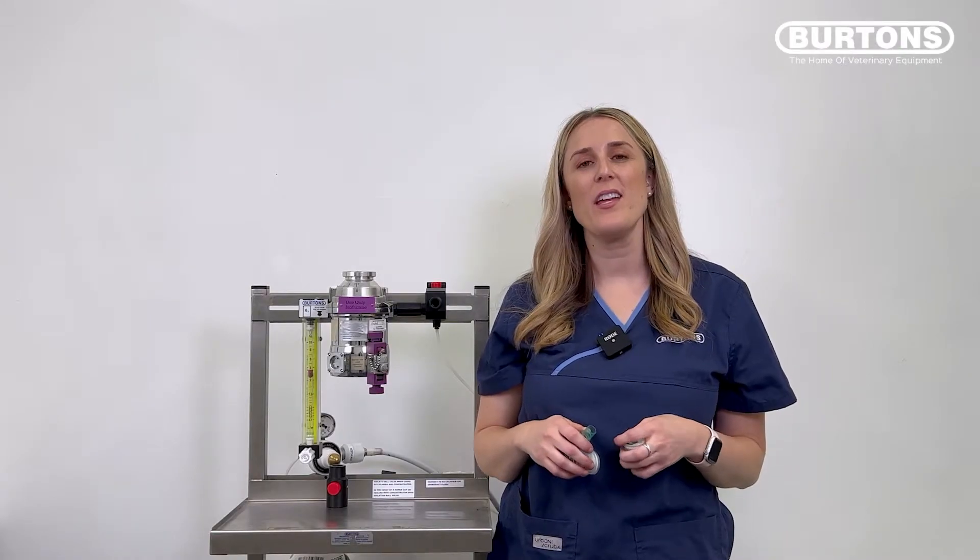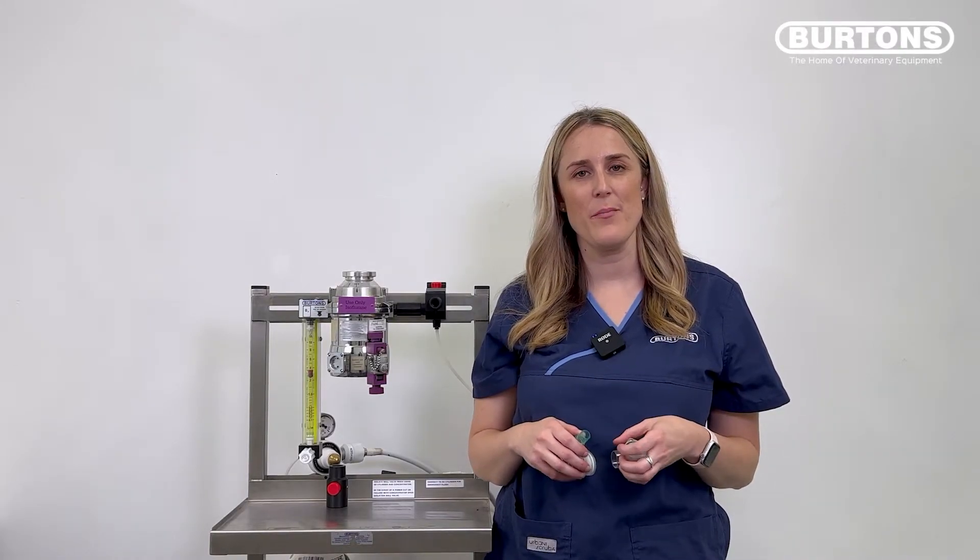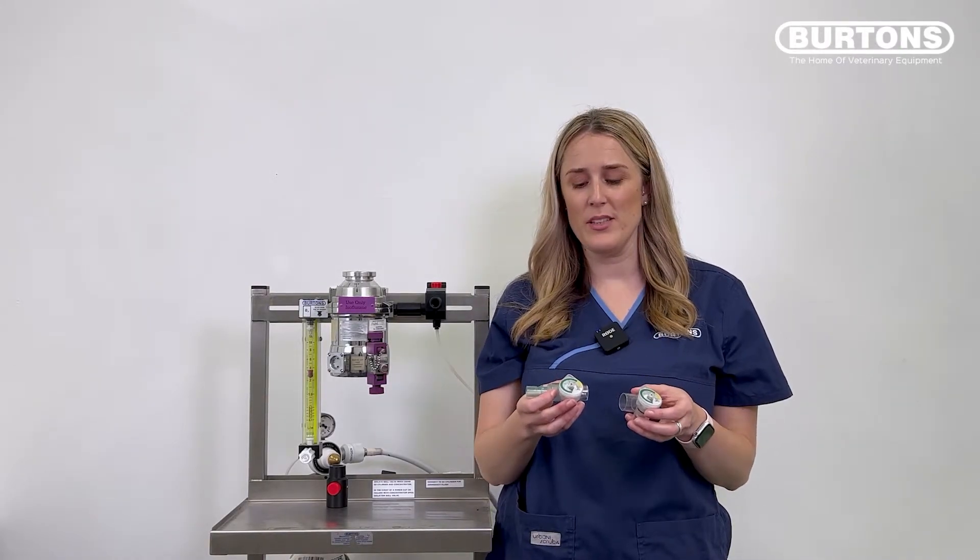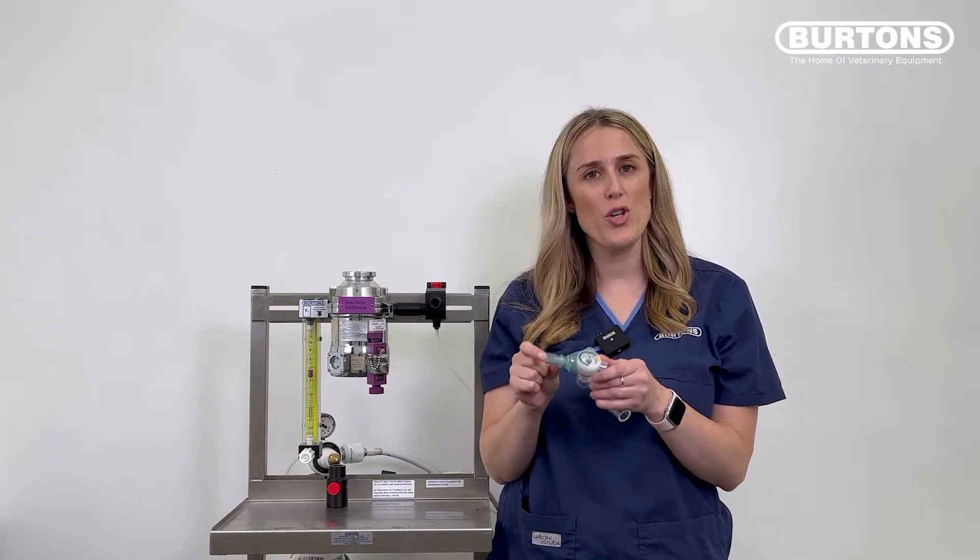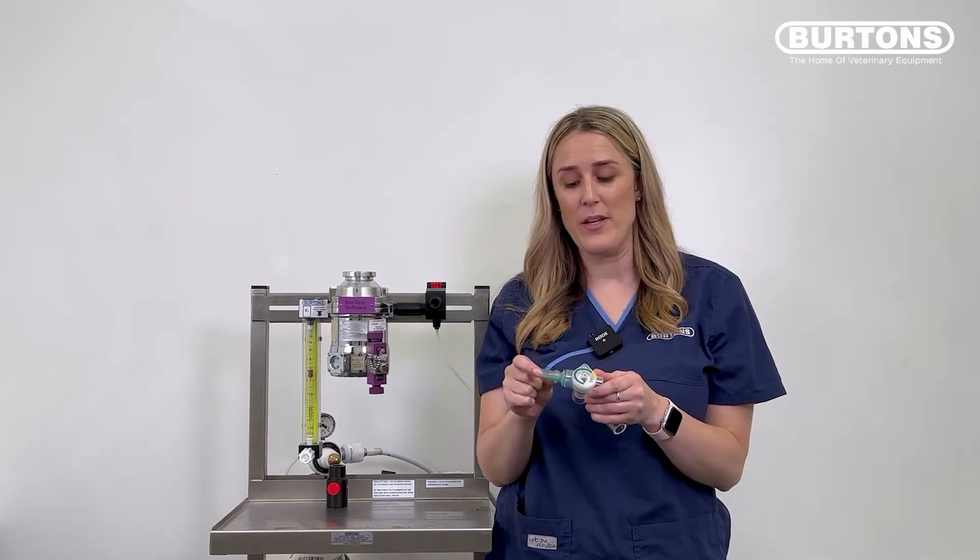We also have a manometer that you can use with a T-piece breathing system. You'll see that they look very similar except with the T-piece version there is an extra attachment that will accommodate the narrow bore tubing that is part of the T-piece breathing system.